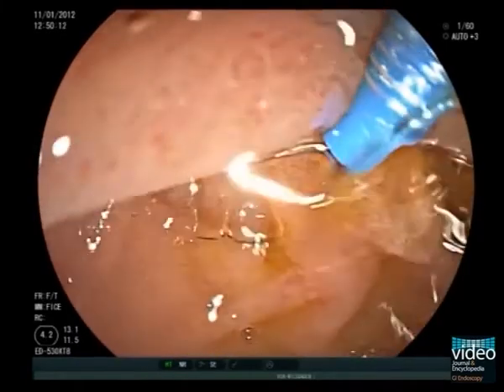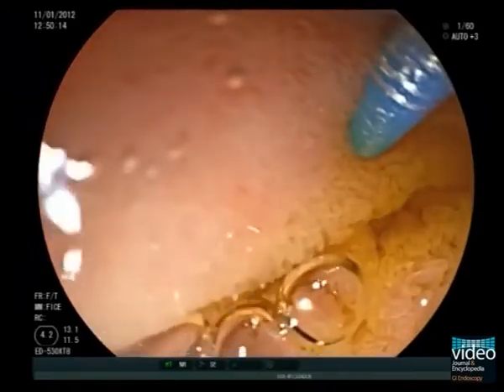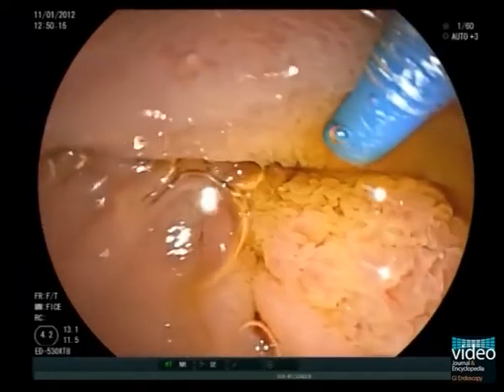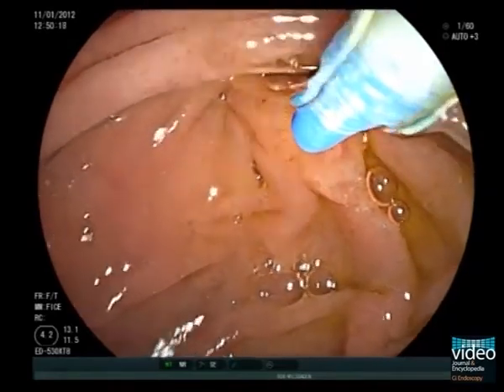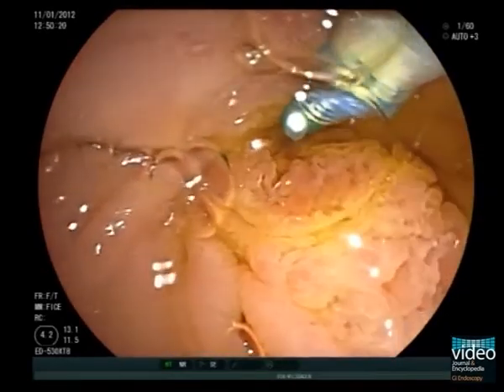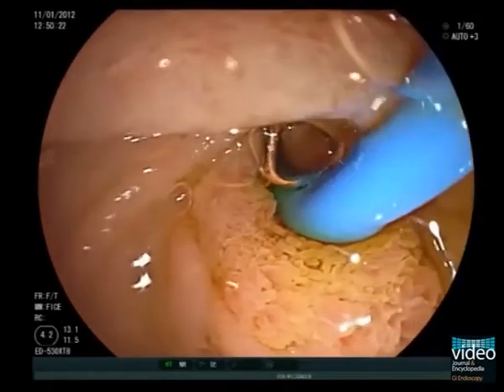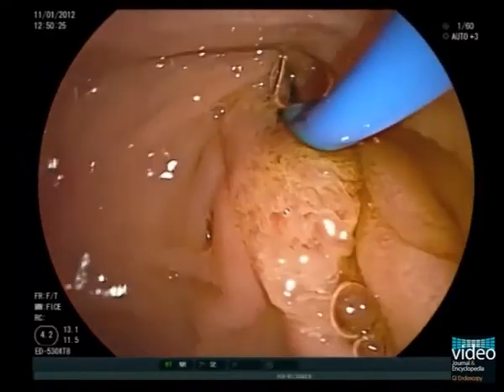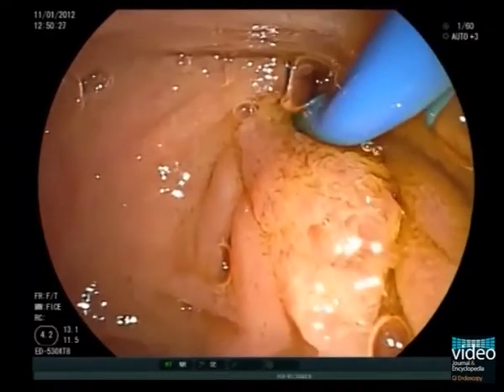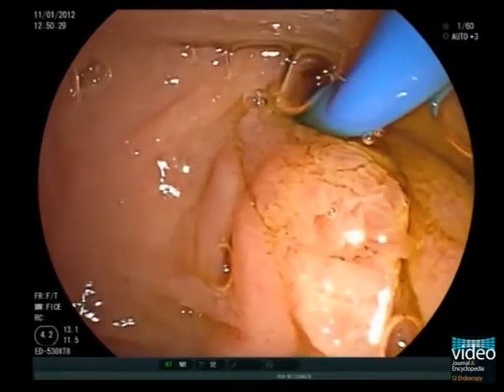In the presence of multiple stenoses, the biliary tree is best explored with a balloon catheter to obtain a selective occlusion cholangiogram of the different biliary segments. To this end, the bile duct is inserted with a balloon catheter. At the level of the distal common bile duct, the balloon is inflated halfway and we gently inject contrast.